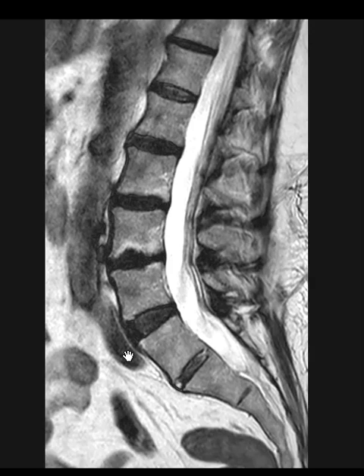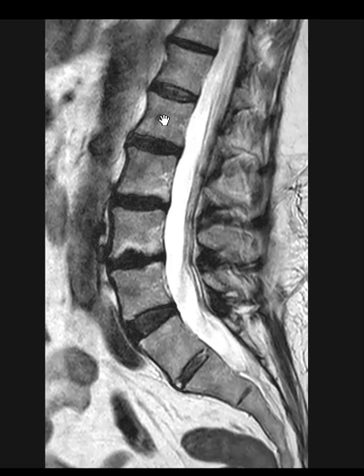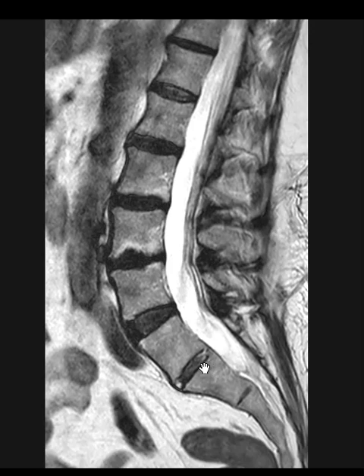On occasion a patient will have a transitional segment down in this area between the lumbar vertebral bodies and the sacral vertebral bodies. They look distinct because the vertebral bodies of the lumbar spine are square, and when we get down to the sacrum, the sacral vertebral bodies are cone-shaped — they are wider at the top and they taper down.